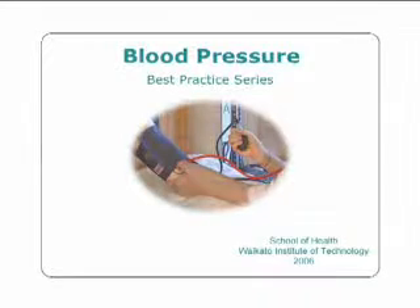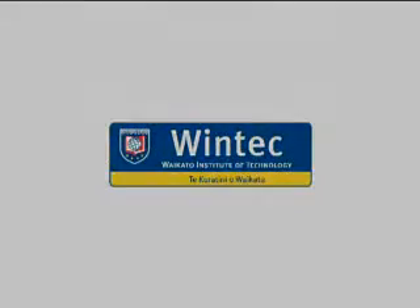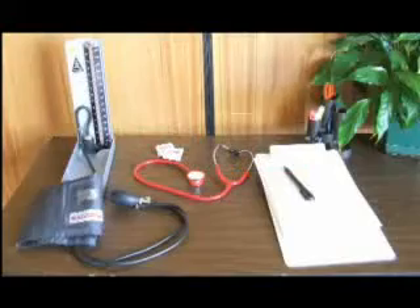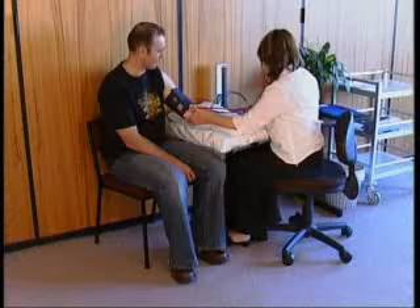Measurement of blood pressure. This presentation will demonstrate the recommended practices for selection of the appropriate equipment for the measurement of blood pressure, preparing the client for blood pressure measurement, applying the cuff to the client, locating the brachial artery, measuring the blood pressure, recording the blood pressure, and concluding the procedure.